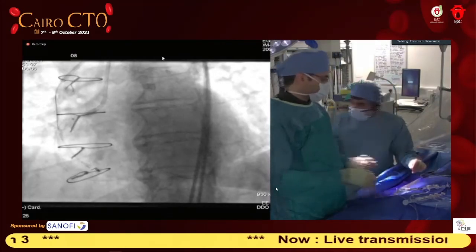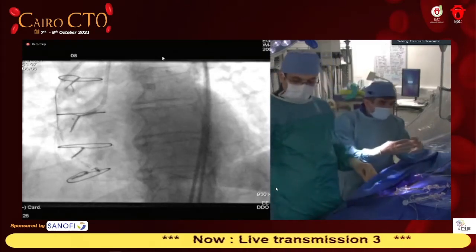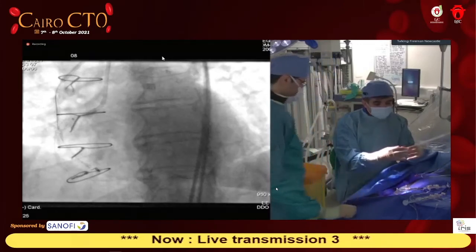As I said, this will need 2 or 3 coils at least. I'm going to take a bigger one, take the 6x6. And I need to see if there's a hairy coil, which will reduce the number of coils I need to use.